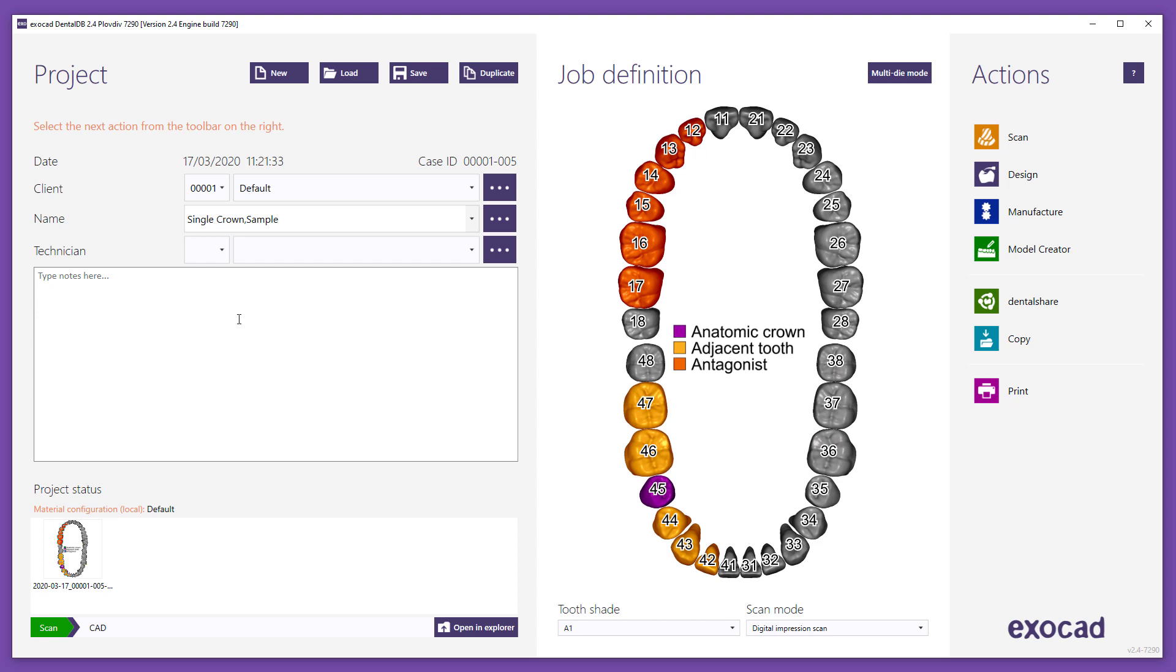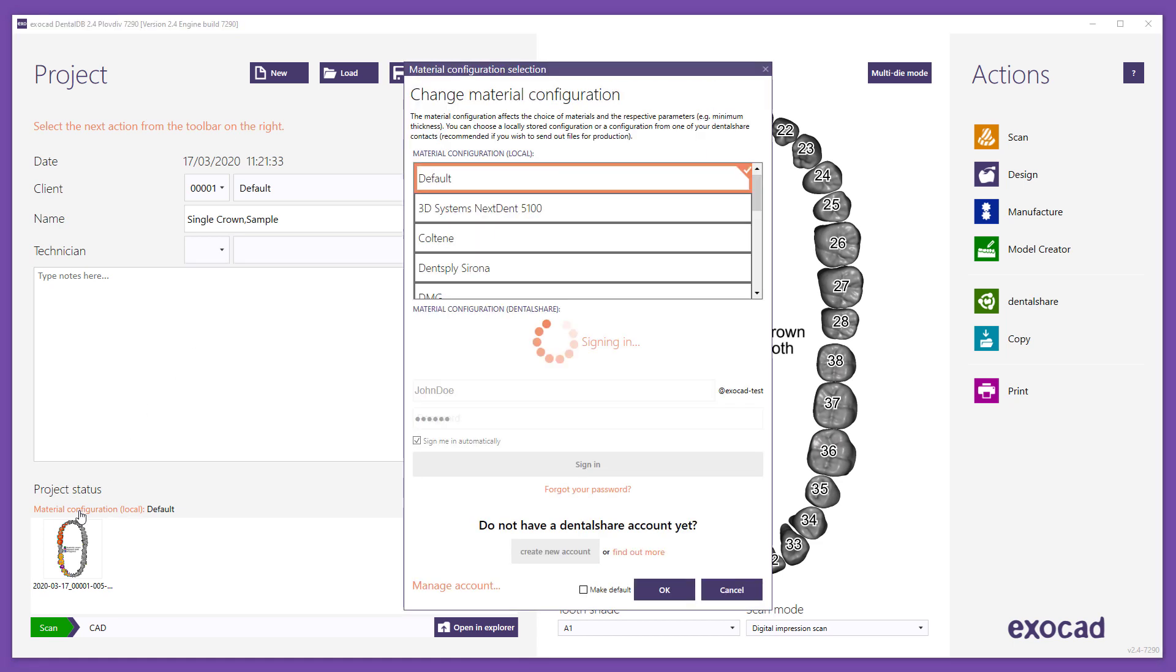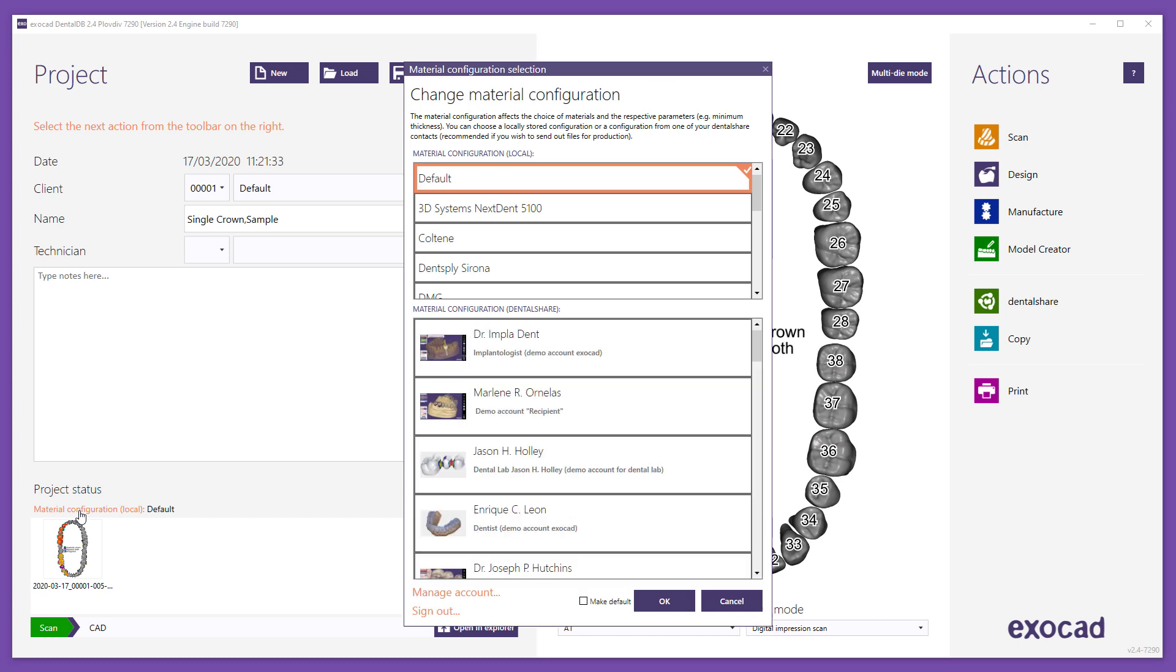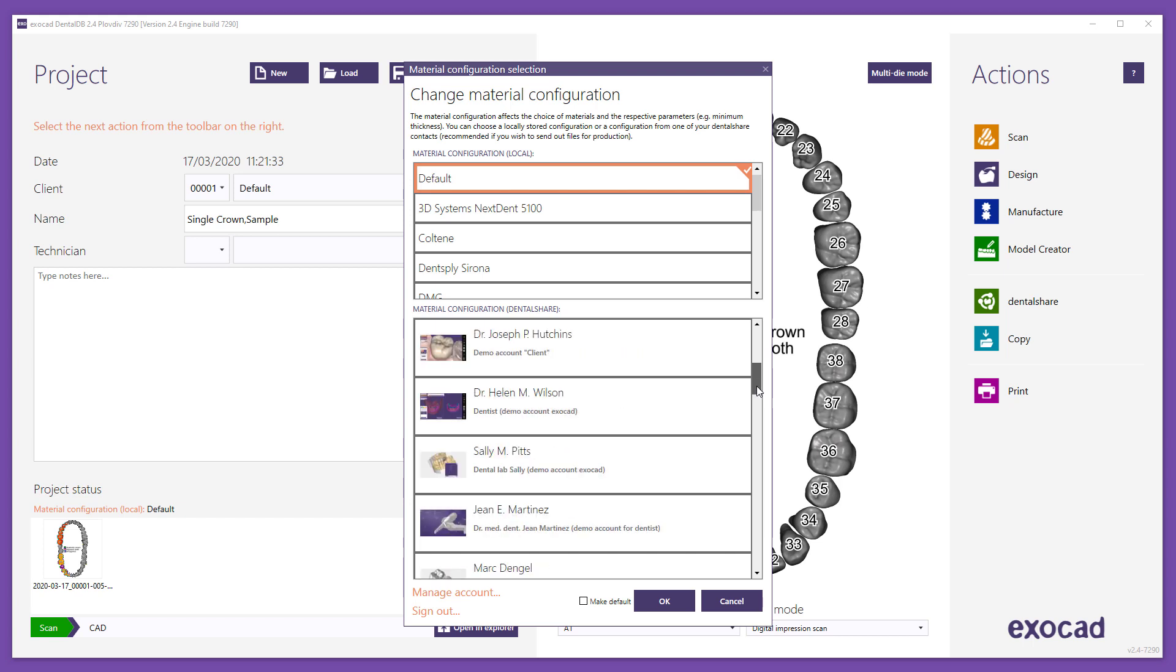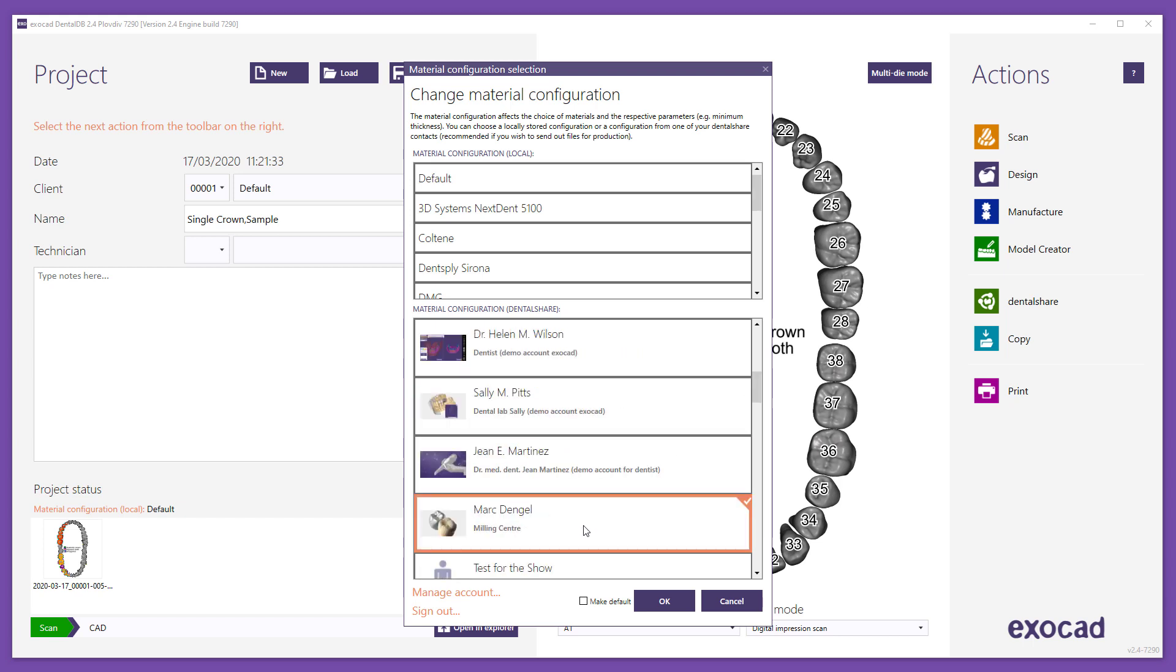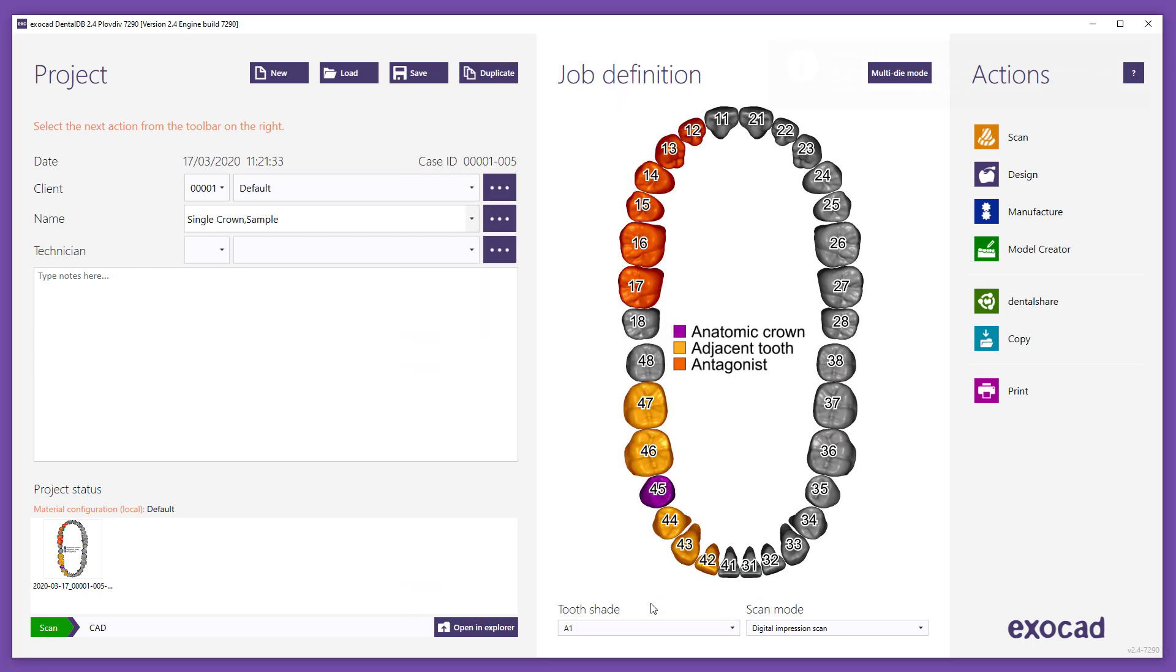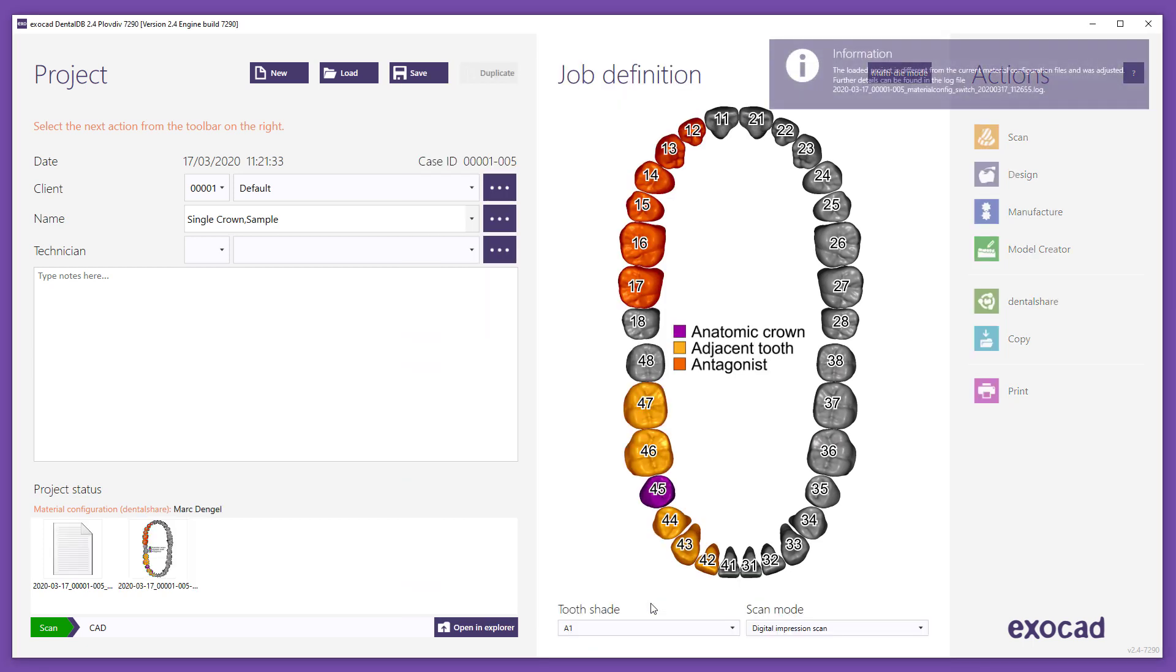Open Material Configuration Selection window. After signing in, select the material list of your manufacturing partner by clicking the contact in the list of available partners. To be able to use the partner's material list, your partner must upload it to the DentalShare platform. Click OK to confirm and close the material configuration window.